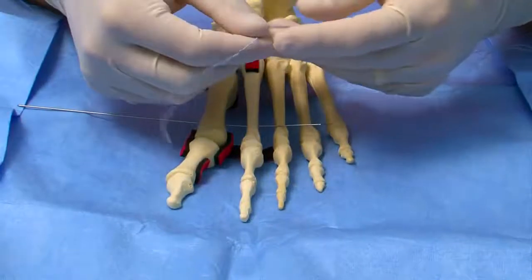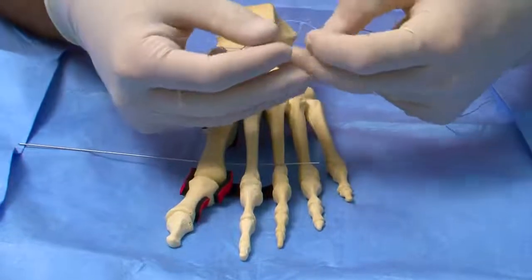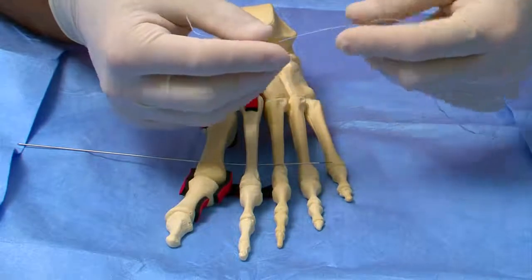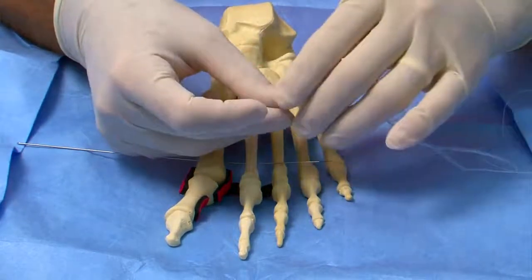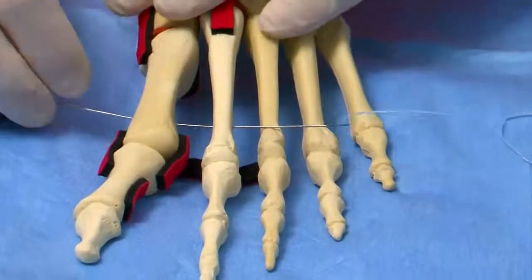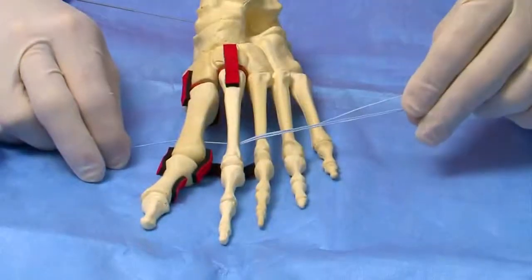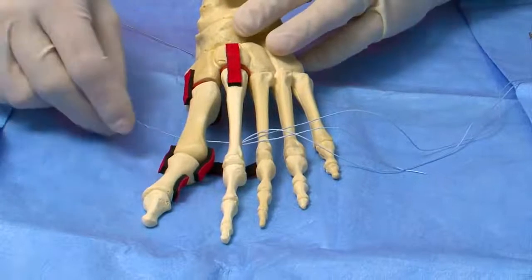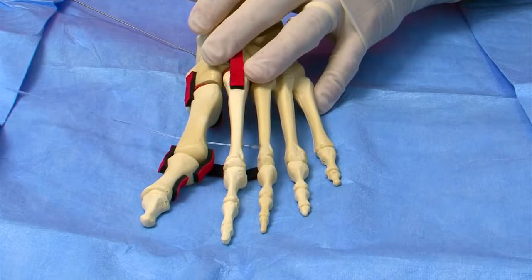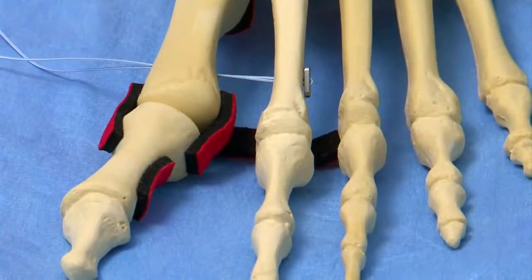The mini TightRope is then taken, and the portion of the tail that the hole was made in, or the first tail, is taken and placed through the nitinol loop, and then passed through the first and second metatarsals. At this point, a hemostat or any type of grasping device can be used to grasp the original tail, and the entire mini TightRope can be passed through the 1.1 millimeter hole.